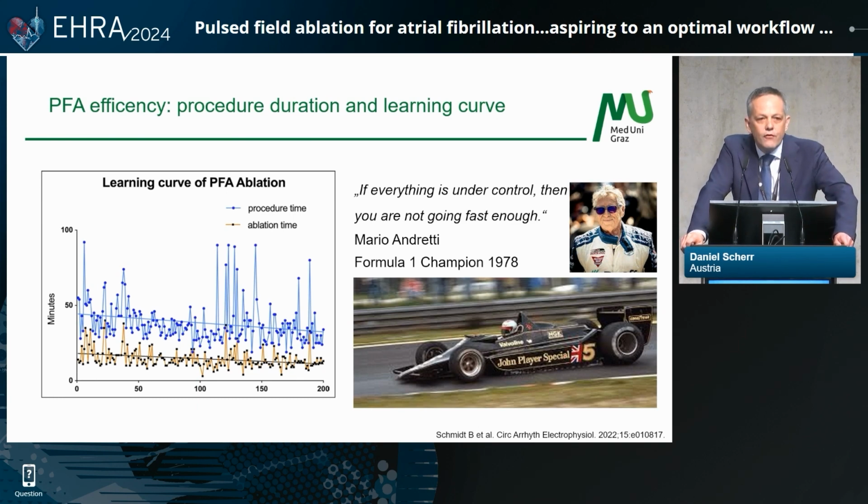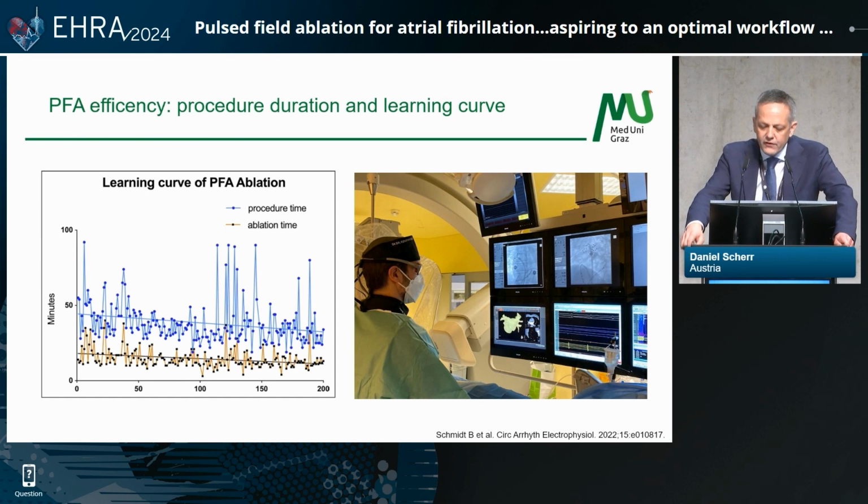The second thing, of course, is the learning curve. And it's a great thing to see how members of your group advance. For example, I want to highlight one colleague of mine, a member of our group, a pediatric cardiologist, who is an expert in doing SVTs, who is joining our lab 2 days a week. And as a pediatric cardiologist and invasive electrophysiologist, he just learned to do the PFA procedure, I would say, in no time.